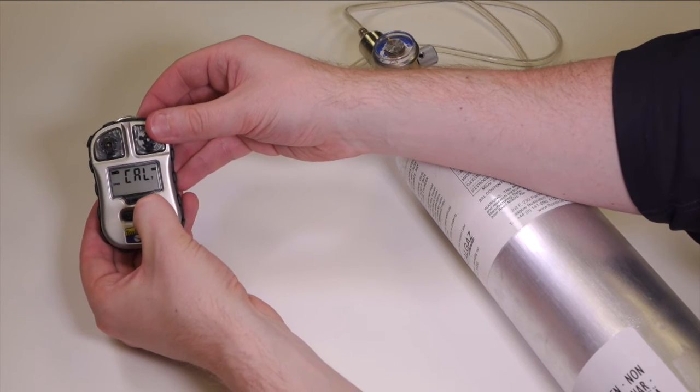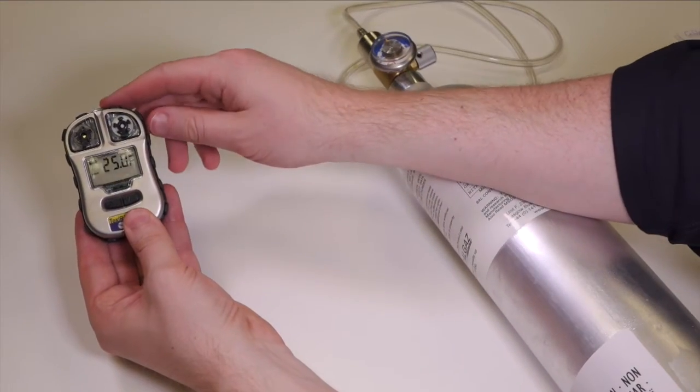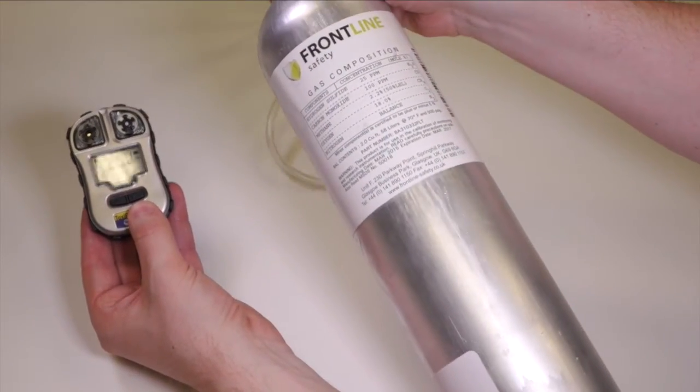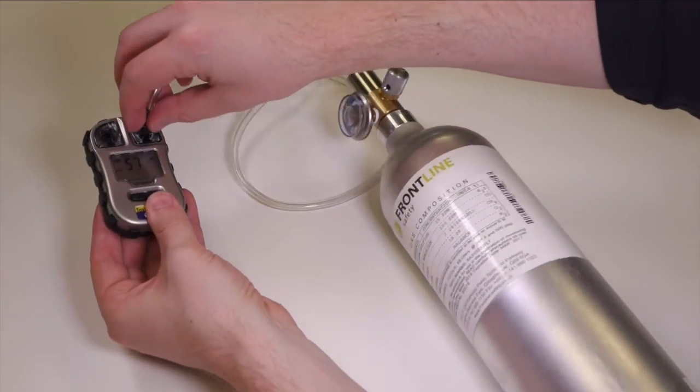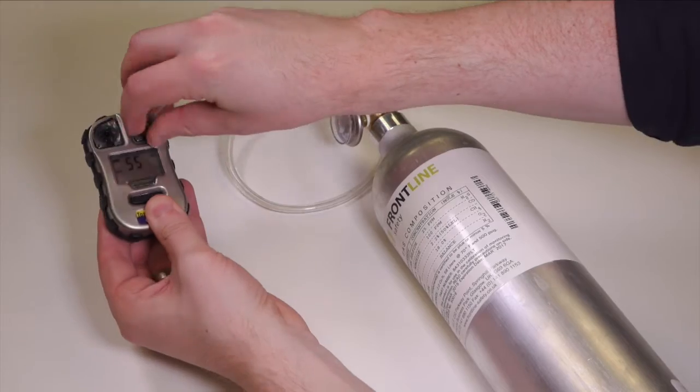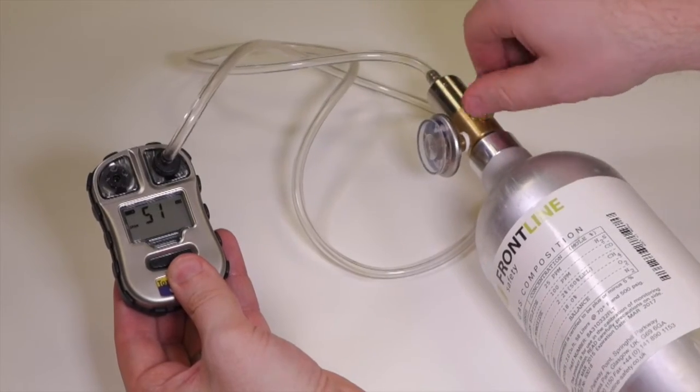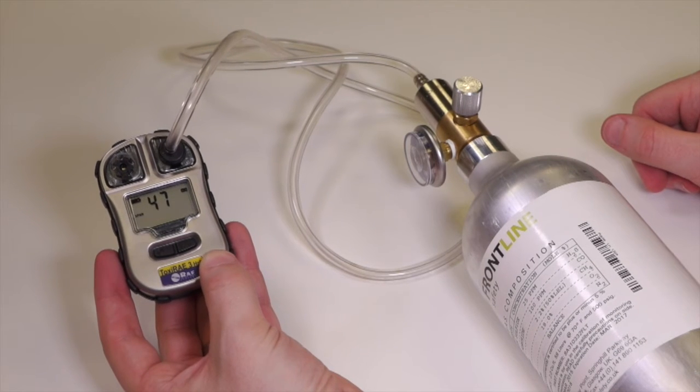So we acknowledge that by saying yes and it's asking is the span gas you have 25 ppm of H2S. In this case, yes it is. So we hit yes, apply the calibration adapter to the sensor on the right hand side and switch the regulator on to full flow and that will take 60 seconds to do the calibration.